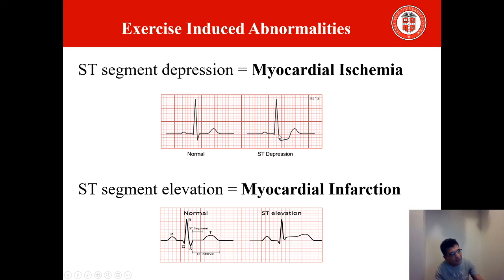You can see that this ST segment depresses or goes down from this red neutral line. You can see it's just above the red neutral line. Here it goes down by 2 small squares, which means it's going down approximately 0.2 mV. So if you have this kind of depression of the ST segment, moving from here to here, it is seen commonly in myocardial ischemia.